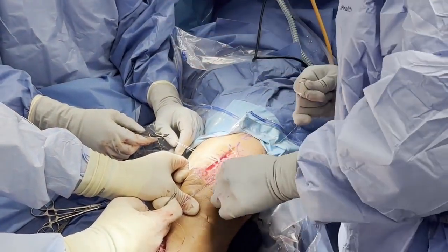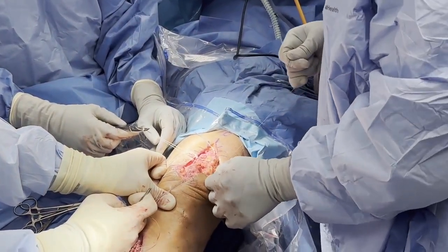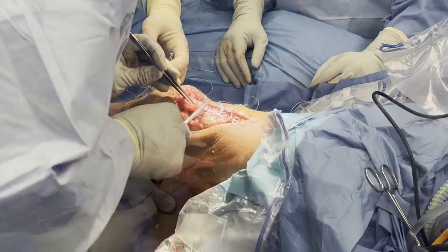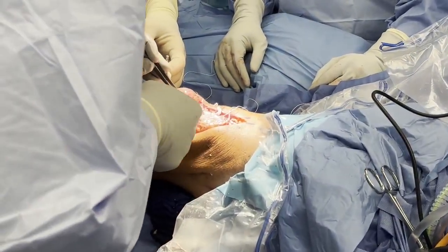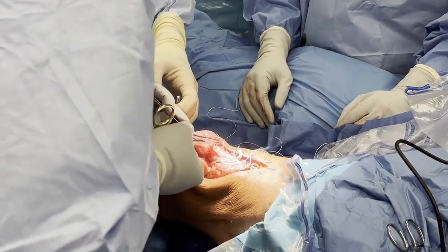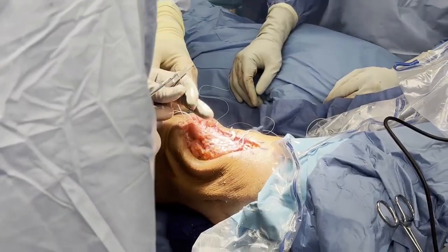As the Q-fix anchor sutures are tied, the patella is positioned appropriately while the quadriceps tendon and tag sutures are pulled distally to gain patellar height. The quadriceps tendon and tag sutures are then tensioned in a pants-over-vest fashion, with the lateral aspect of the quadriceps tendon coming on top of the medial aspect.